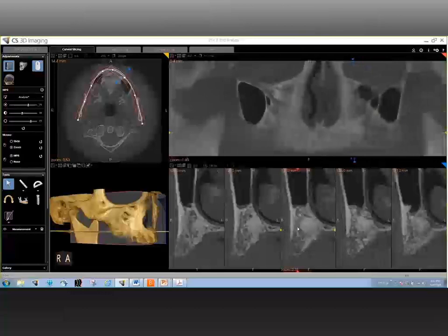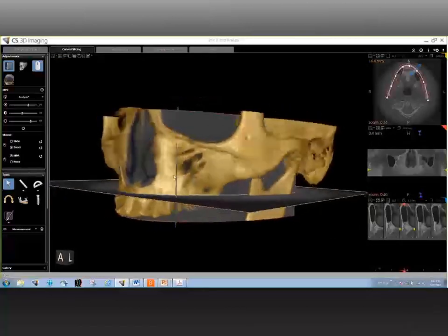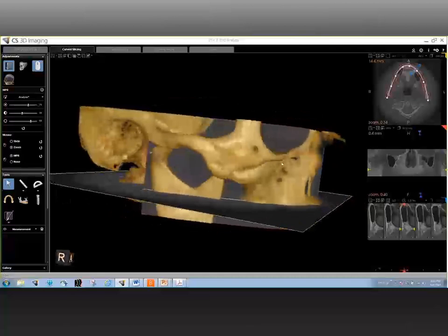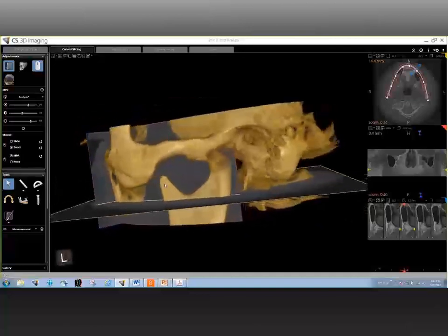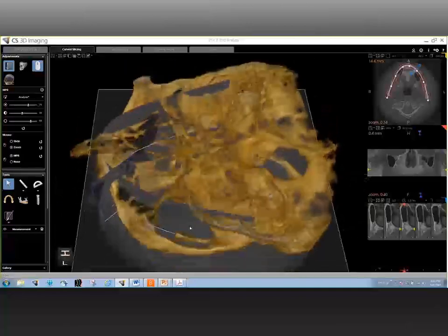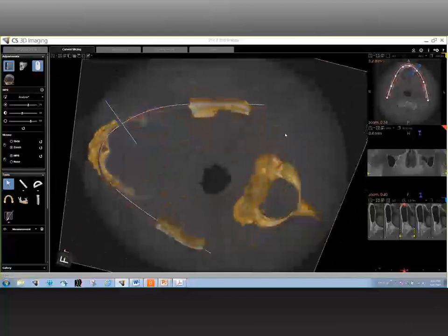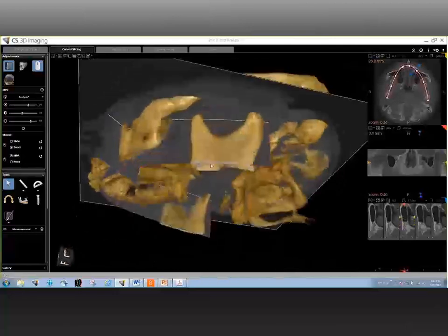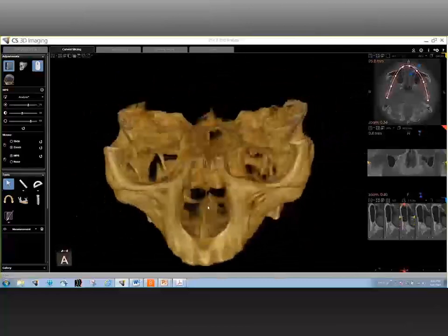I noticed on this CS9300 Premium 17 by 6 centimeter scan — the field of view we are working with, just one of many different field-of-view options for the CS9300 — that one could visualize more than just the maxillary region; one could also see and evaluate the bilateral TMJ. By having a larger field of view, you'll be able to capture a little bit more than the maxilla, including the TMJ area. But by limiting the field of view and just capturing the maxilla, you would also save the patient from additional radiation and capture just enough anatomy needed for a certain procedure. It is a responsible way to limit the field of view to reduce the amount of radiation.